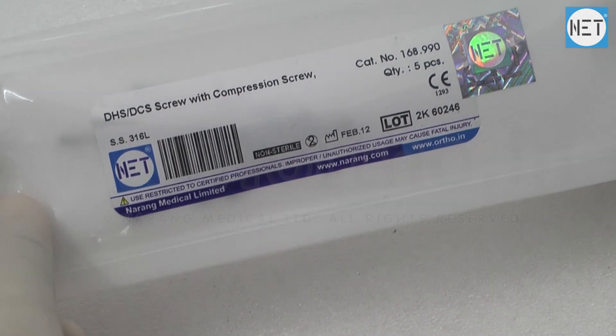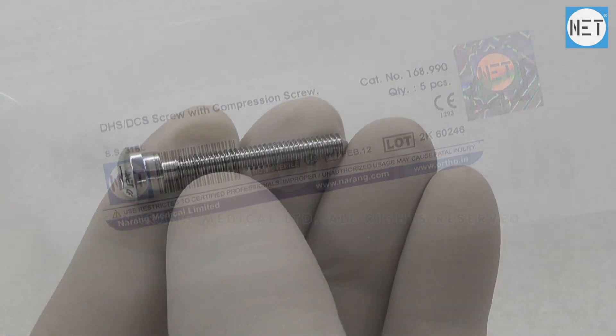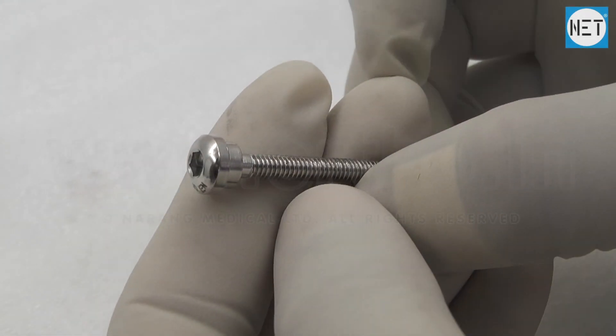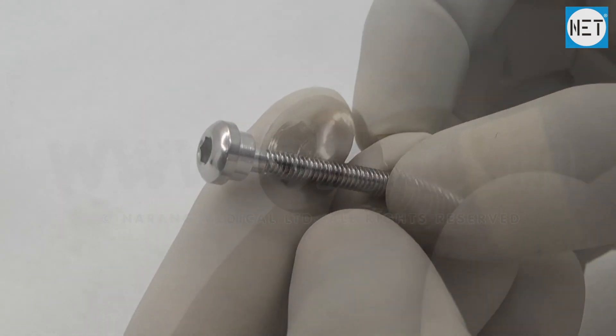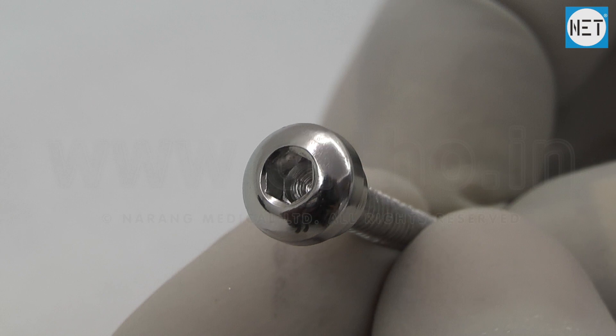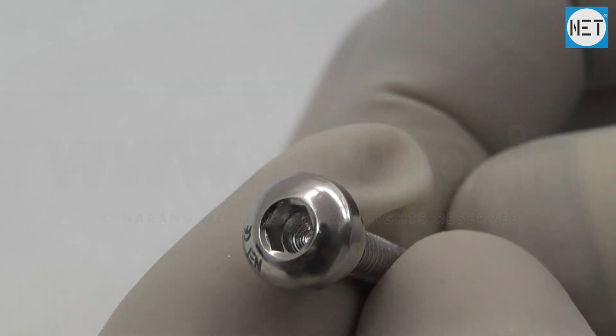Net Brand Compression Screws are used with dynamic hip compression plates during fixation of femoral fractures. These screws are designed separately for adult and pediatric use, and are available in stainless steel and titanium.